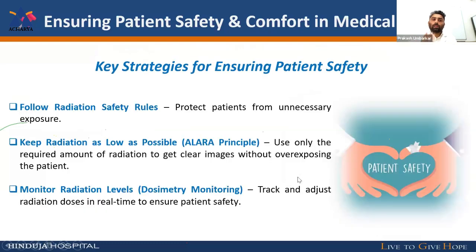Number one, how to ensure the safety of the patient. Don't forget the rules. That is the safety rule. Keep the ALARA principle, always keep in mind as low as possible radiation dose to the patient. We don't want an extra dose to the patient, just the least amount of radiation received while getting a very good quality image.